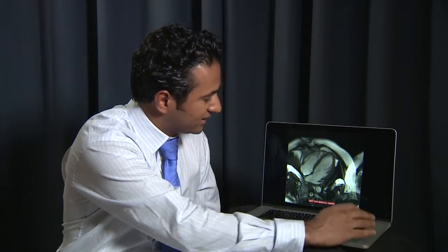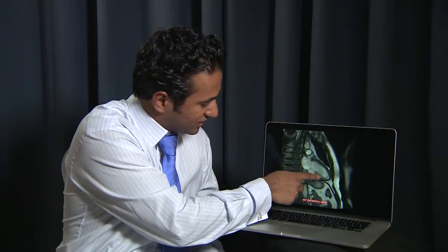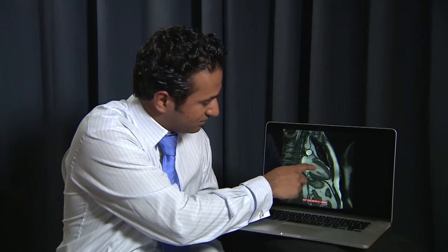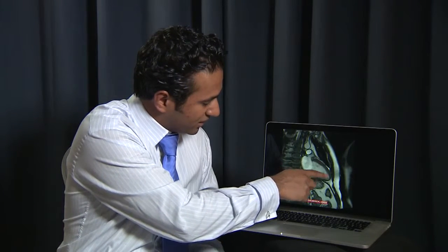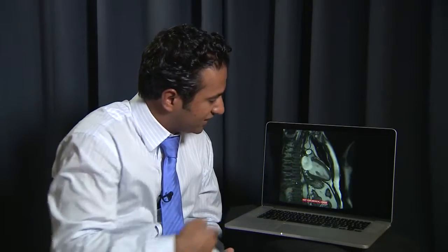We can nicely assess the function. This is another view — what we call the two-chamber view. Here we can see the left ventricle, this is the blood pool, this is the myocardium contracting, this is the left atrium, and this is the mitral valve here, and we can see that very nicely.